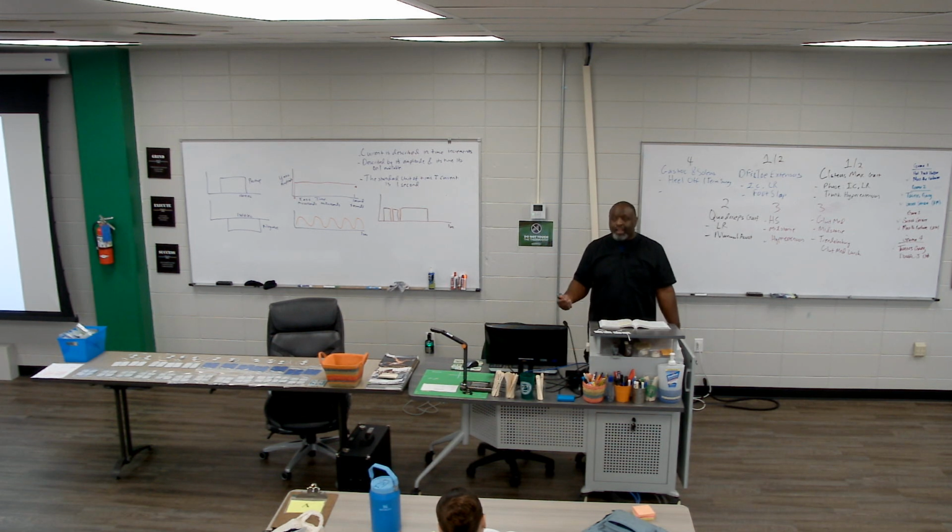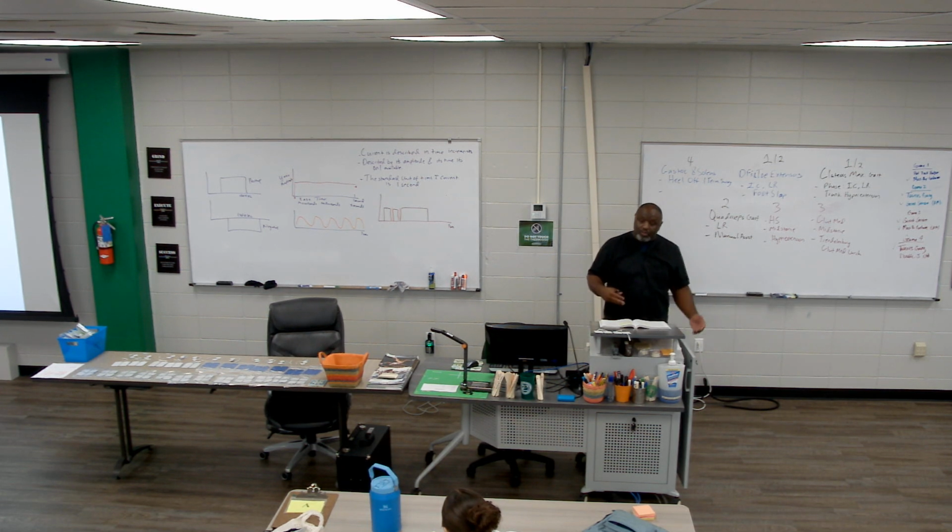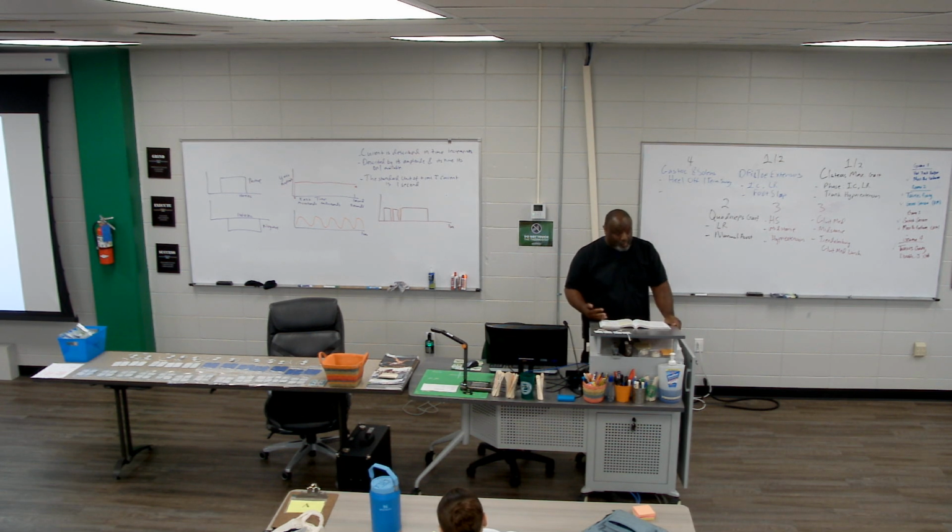There are times where this actually helps people get better faster. So if I know this is a technique that's going to help my patient, I want to do everything I can to make it comfortable so they can tolerate it, so we can get them better. So that's our whole objective. If the waveform I'm using isn't working, try another one, as long as it accomplishes what I'm trying to do.